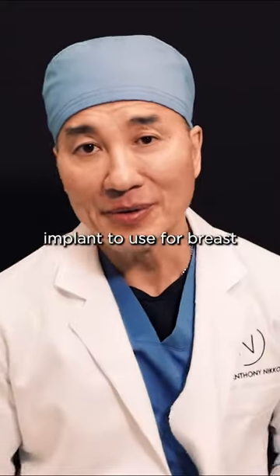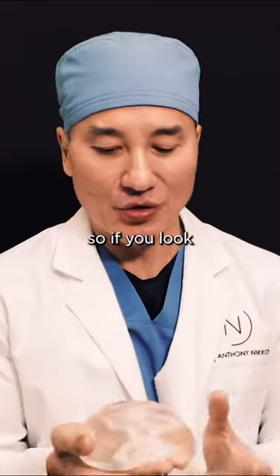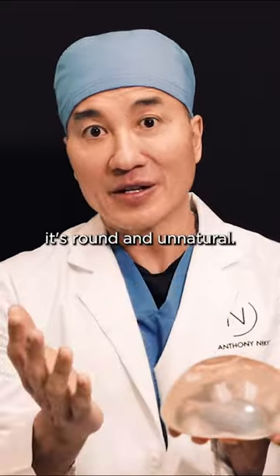My favorite implant to use for breast augmentation is the ultra high implant. If you look at the ultra high, you can see how full it is — but you would think it looks round and unnatural.